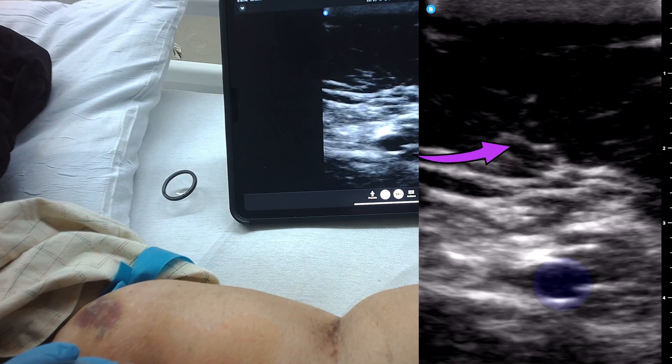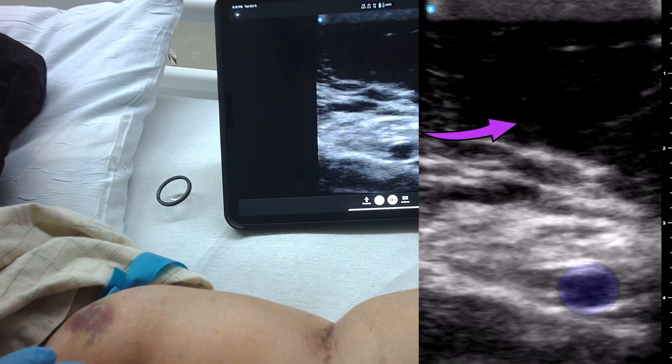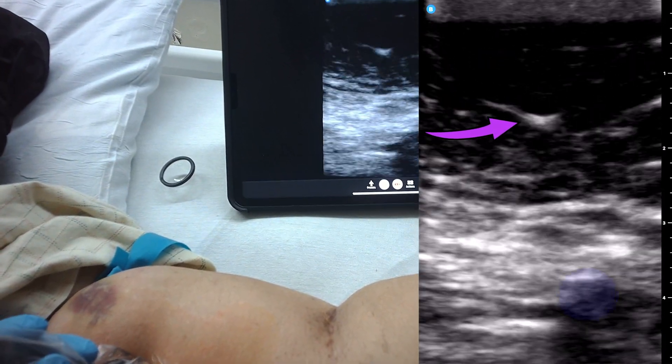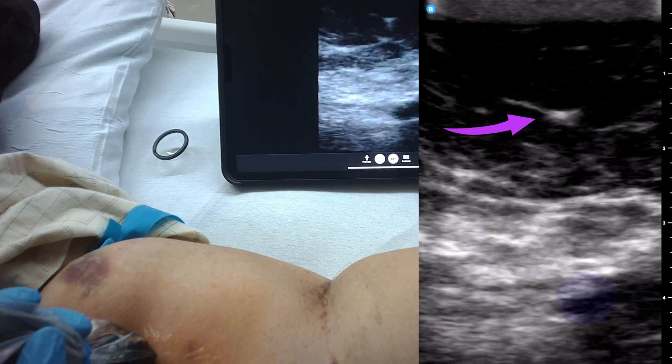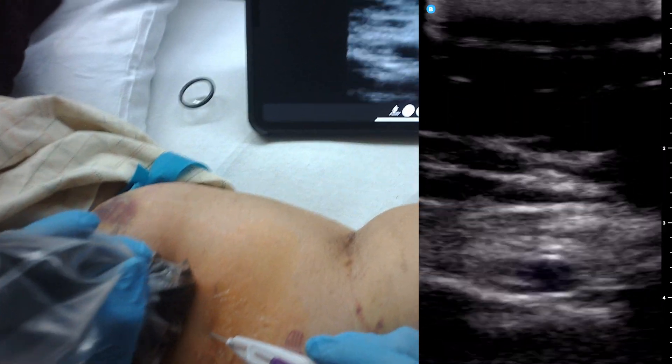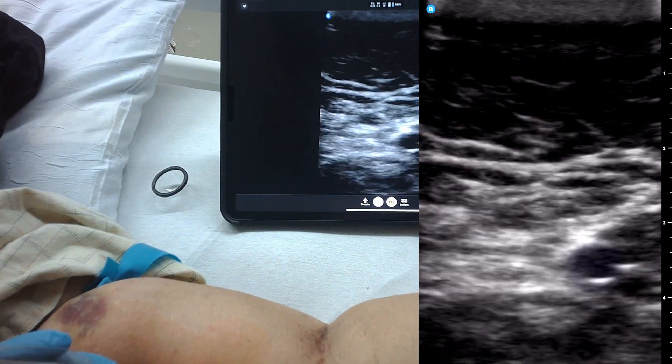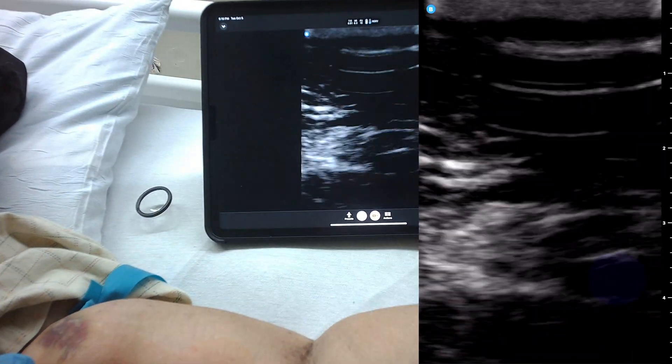It could be, actually — let's see. This is also why I don't like using the needle guide, because you need to fan the probe to be able to see. I'll show you what I do with that and the needle. Unfortunately, with the needle guides, you can't do that.